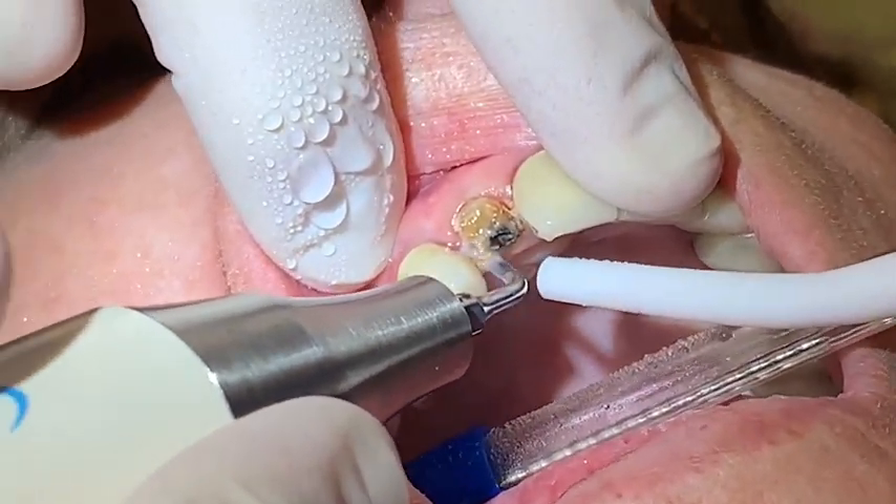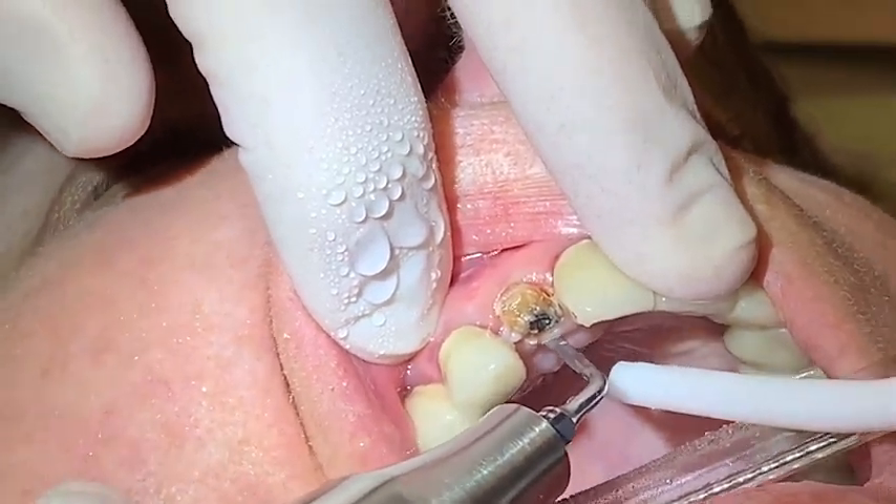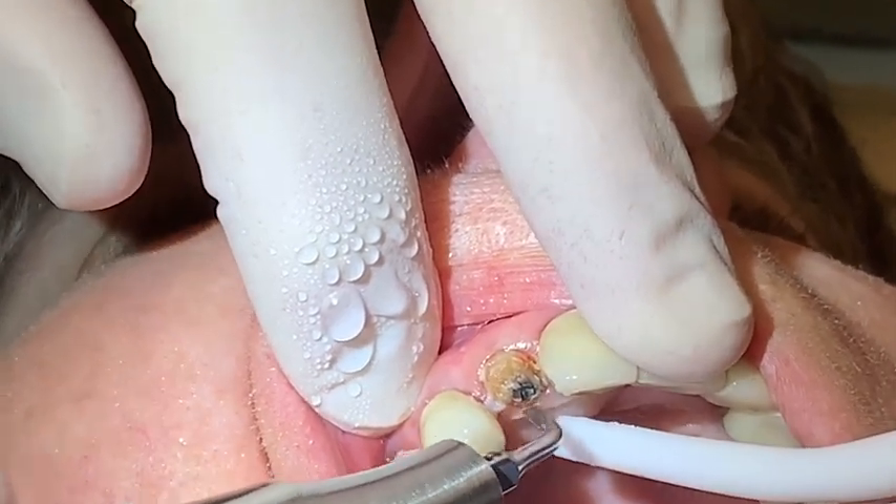It is never held in place for any length of time. If it needs to go to a different aspect of the tooth, it is removed, the foot pedal is released, and then started again and inserted into a new spot.